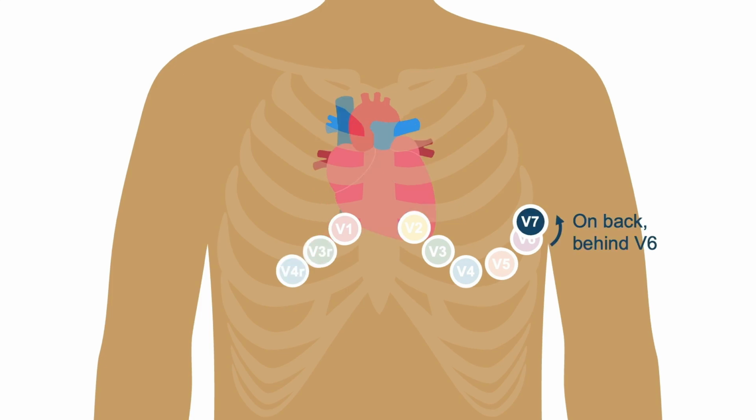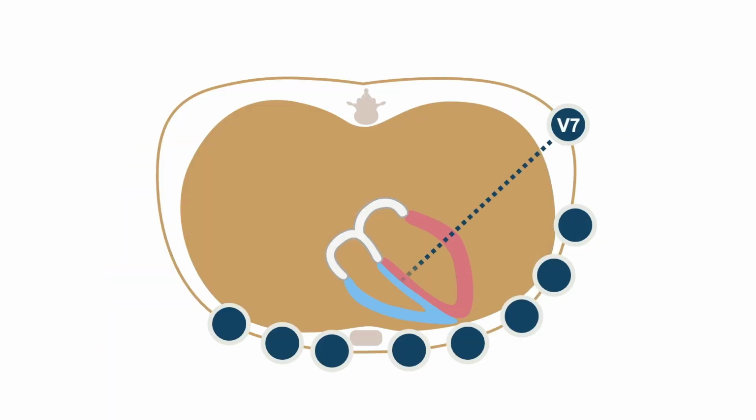The third additional ECG lead for pediatric patients is V7, recorded by an electrode placed on the left side. V7 provides information on the far left side of the heart, specifically the electrical activity on the lateral wall of the left ventricle, helping to identify electrical abnormalities that standard leads might miss.